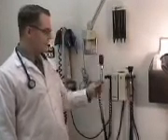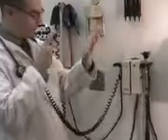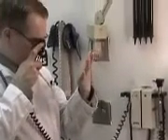The next part of the visual examination involves the use of the ophthalmoscope, which can generally be found on the wall hanging here with a cord to a machine that generates the energy for the light. Once the ophthalmoscope is taken off the wall, the light is automatically turned on and there's no need to adjust it. To adjust for your own specific vision, there is a dial on the ophthalmoscope that you can turn, look through, and adjust to your own ability to see.